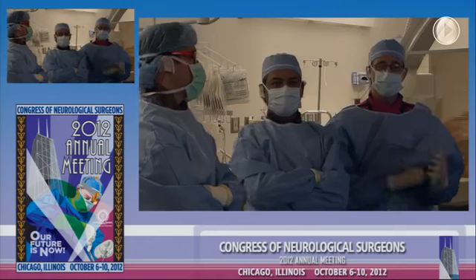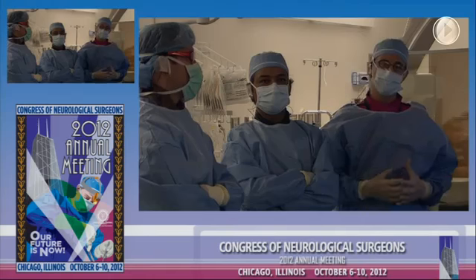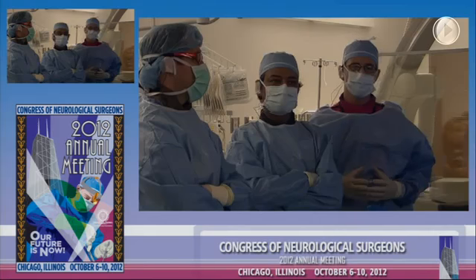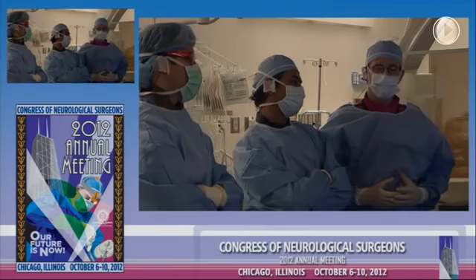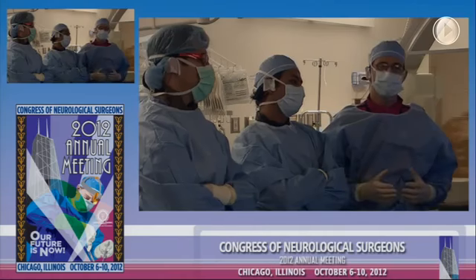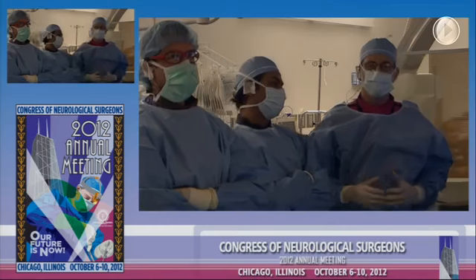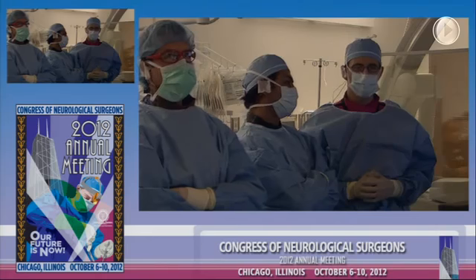Other options for that aneurysm include a bypass procedure. But again, you saw we're able to do this awake in about 30 minutes. So from a patient morbidity standpoint and from a skill set of an institution standpoint, obviating the need for a high flow bypass or another type of bypass for this type of cavernous aneurysm is a huge iterative jump in technology and a huge step forward for aneurysm treatment.